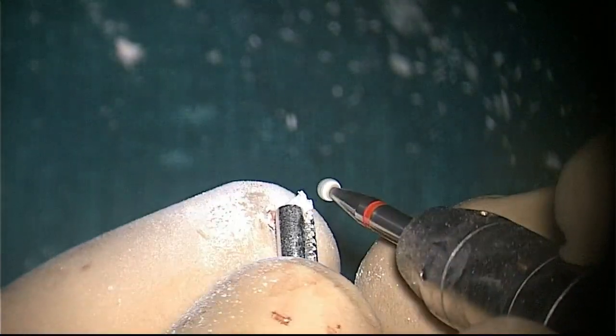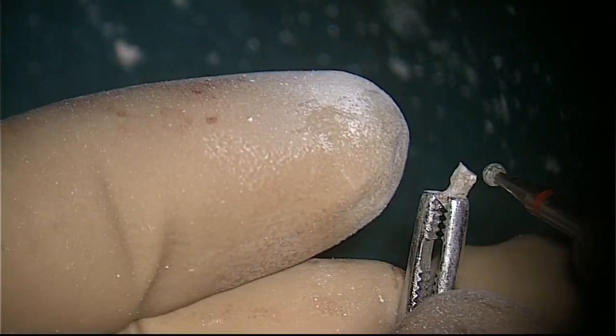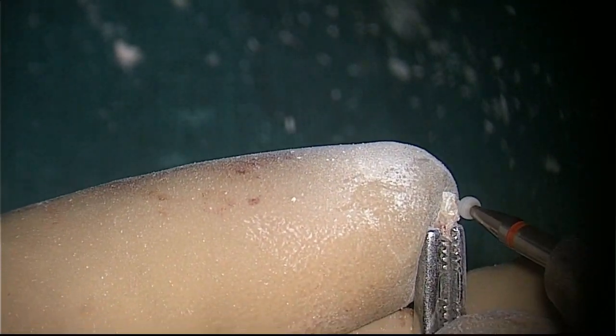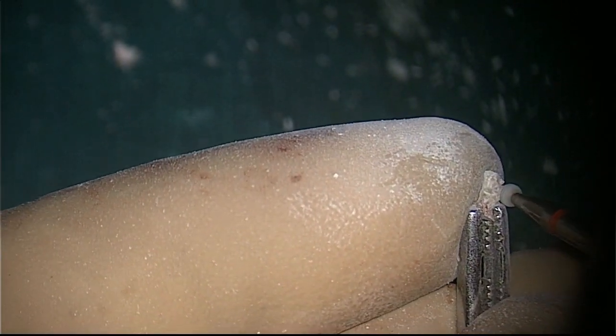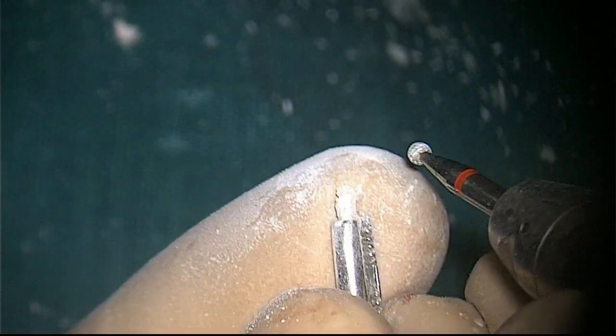So you can straighten the malleus like this so that it will not have any problem in keeping on the footplate. You can see that I am making the malleus straight with the suitable size burr.